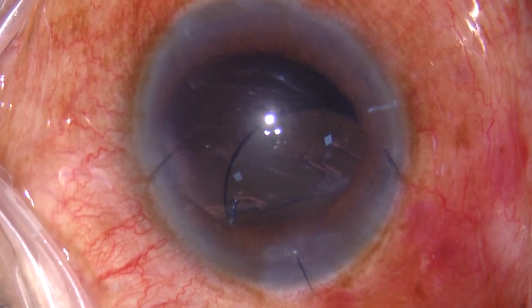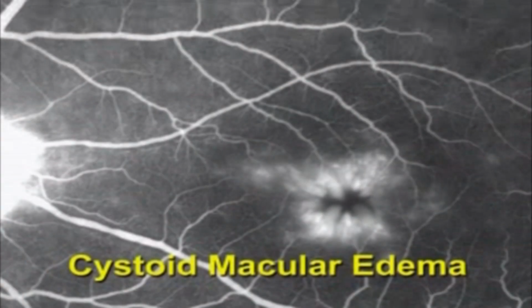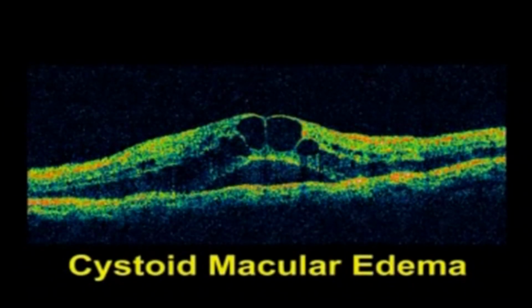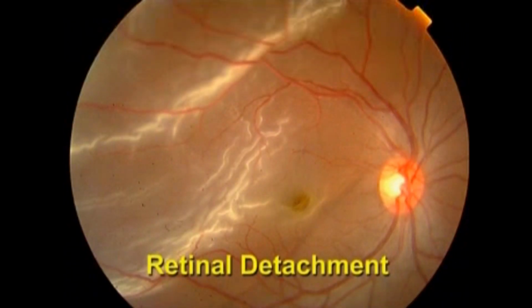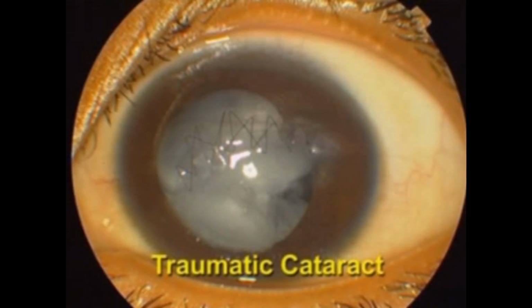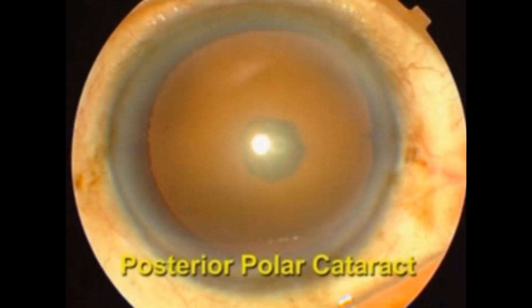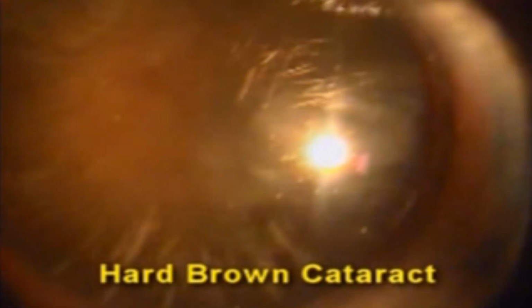Failure to manage the PC rupture and the vitreous loss correctly can lead to cystoid macular edema, retinal detachment, secondary glaucoma, and even postoperative endophthalmitis as well. Anticipate PCR in a patient with traumatic cataract, cataract post-vitrectomy, posterior polar cataract, hard brown cataract, cataract with pseudoexfoliation, etc.